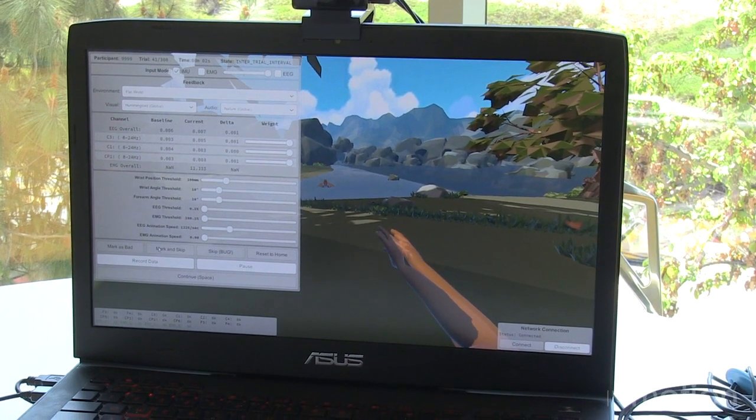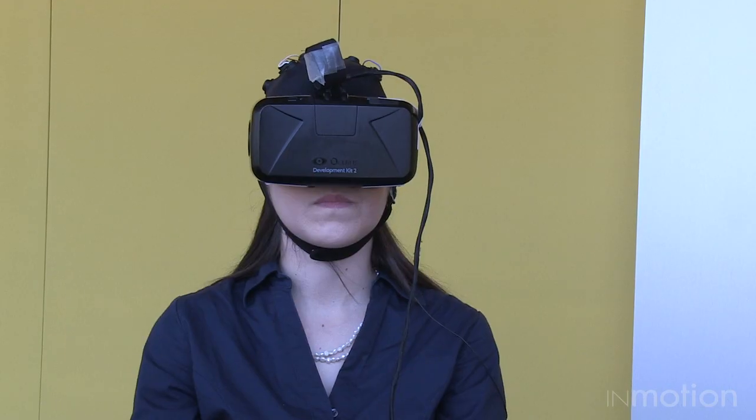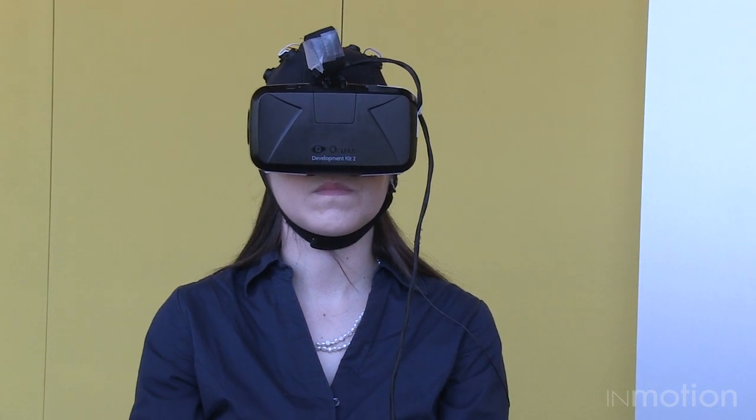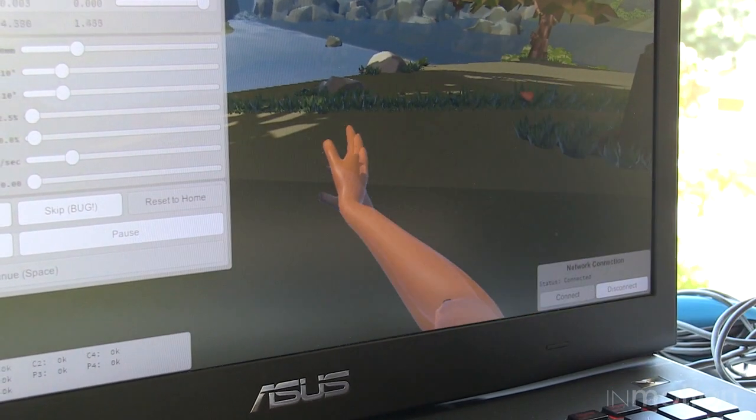So normally we train the brain by actually moving the hand, and that's what therapy does most of the time. But when they can't move, this is considered like a backdoor. We can just read the brain signals that are good and reinforce them by showing them a hand moving in virtual reality.